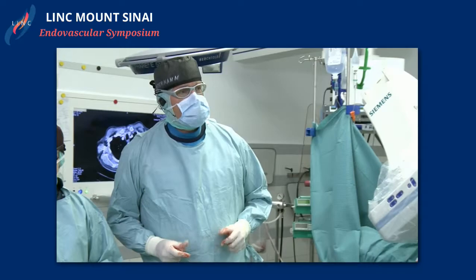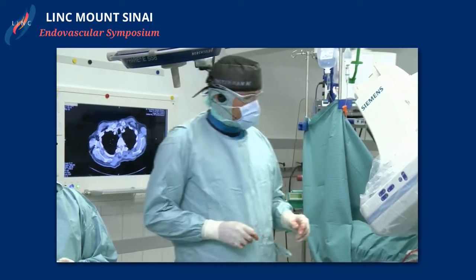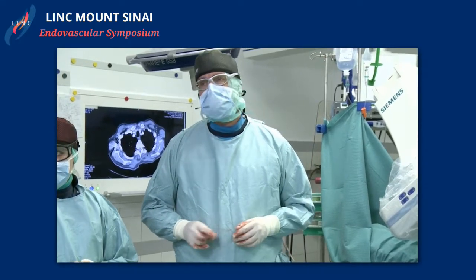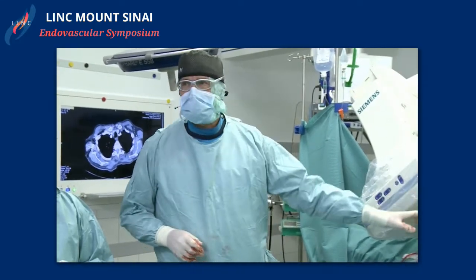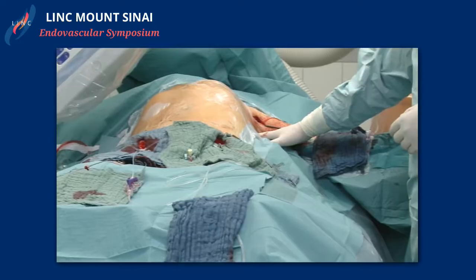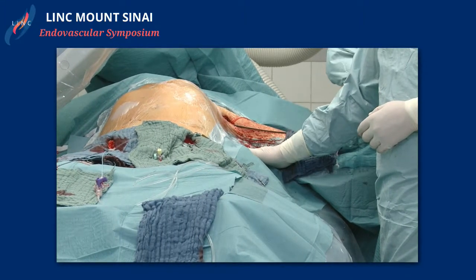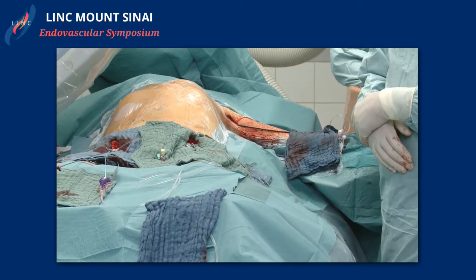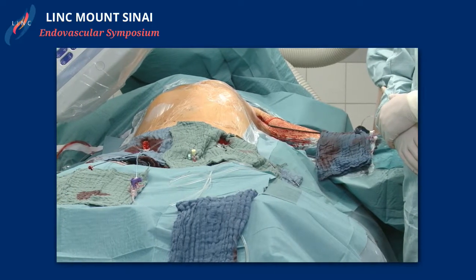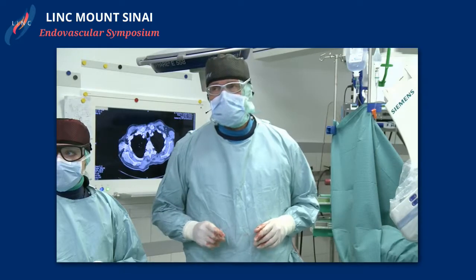So thank you. I want to show you what we have done up to now. We start with a cut down of the left axillary artery. Maybe we can show it. The left axillary artery. It's a nice access, not only for one sheath. You have in most cases space for up to, I think, about 3 sheaths. But in this case, we only plan one chimney endografting.